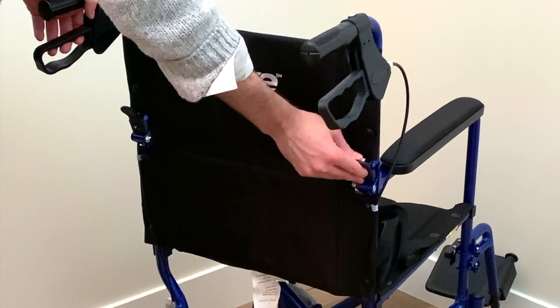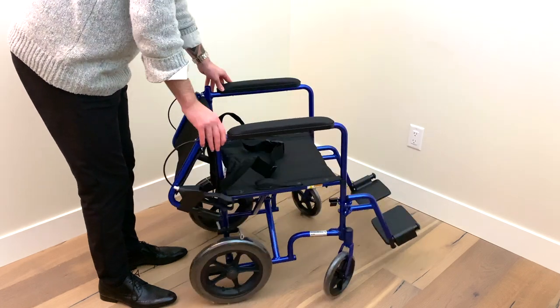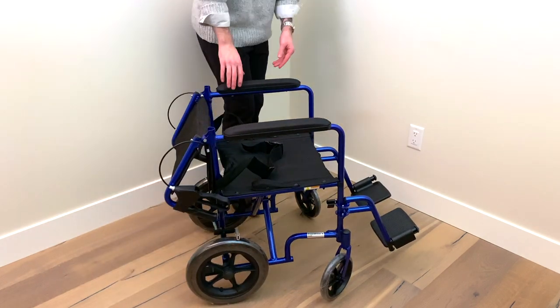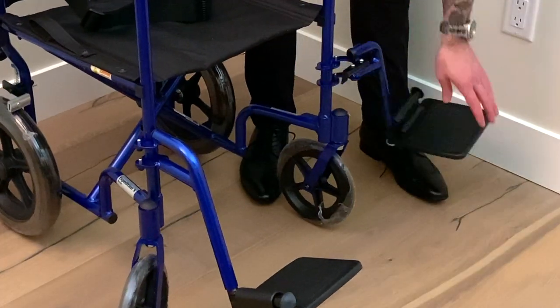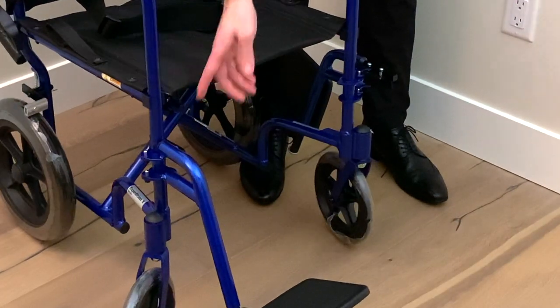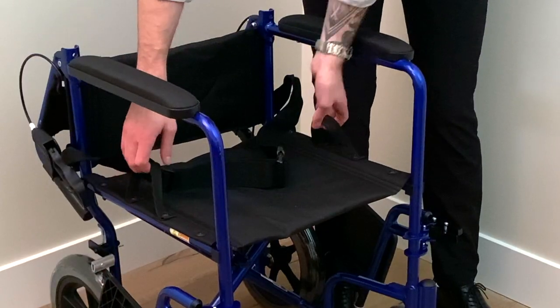To collapse your chair, push the tabs on the handle and fold the backrest out of the way. Then, pull the tabs to unlock the footrest and swing them to the side. Finally, pull up on the seat rails to collapse your transport chair.